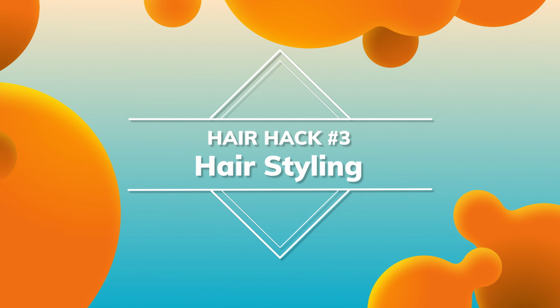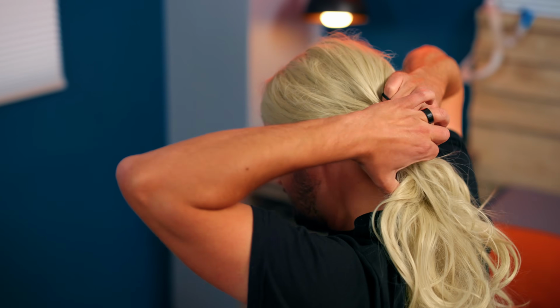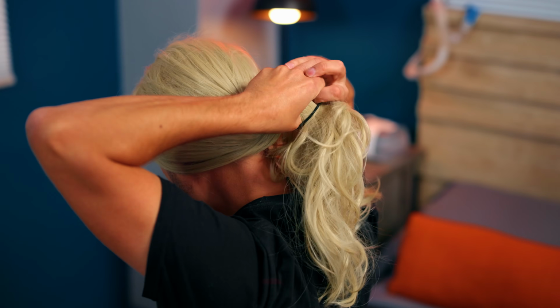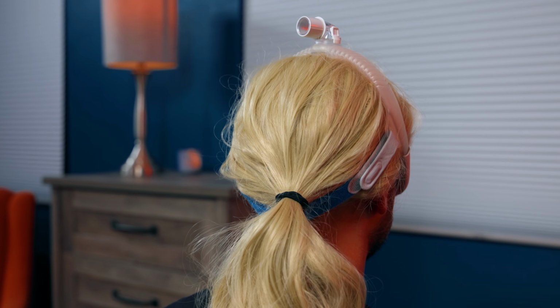Hack 3. If you have long hair and you find that the straps slide up your skull while you sleep, a common trick is to wear your hair in a low ponytail or a bun. Then you can position the strap beneath your ponytail or bun so that it acts as a sort of anchor to prevent the strap from sliding up.